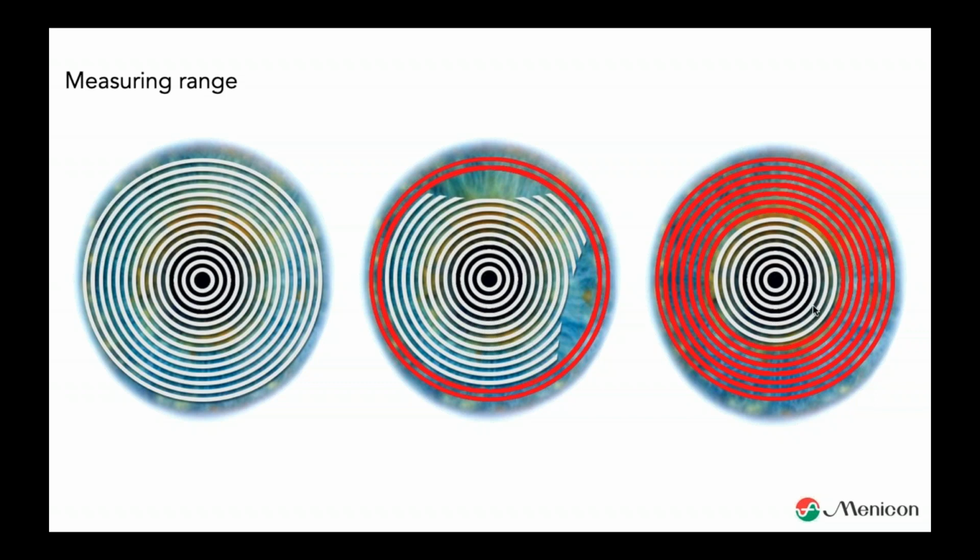So again, if you are thinking about buying a topographer, make sure you get one of these two. Honestly, if you buy a new topographer, most of them are in this section already. Those are the cheapest, the oldest ones, so most of the time the second-hand ones. If you buy for the future, stay away from these, in my perspective.